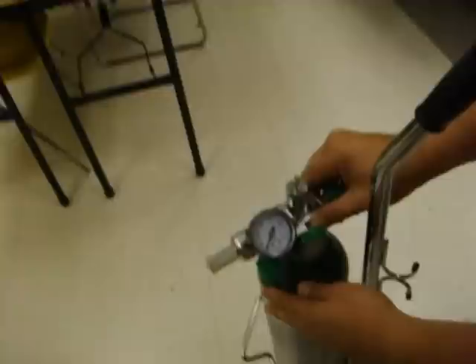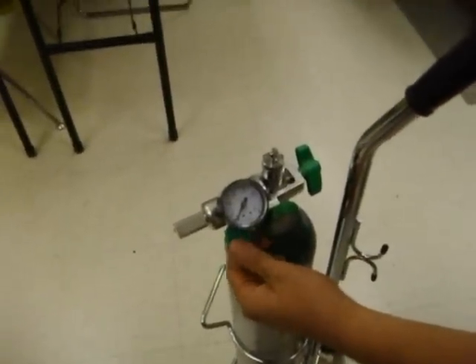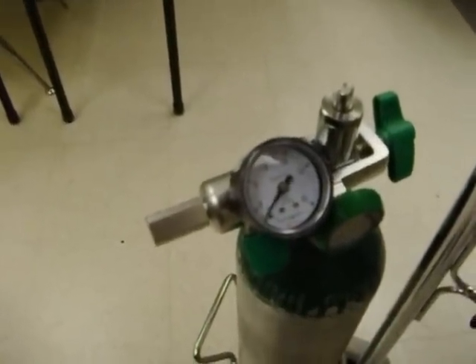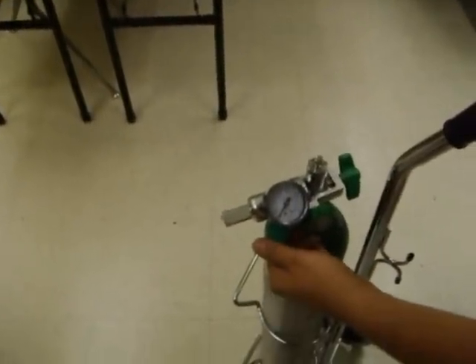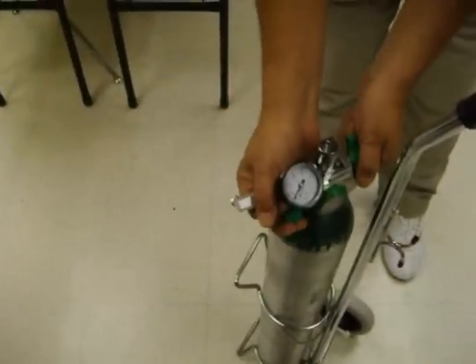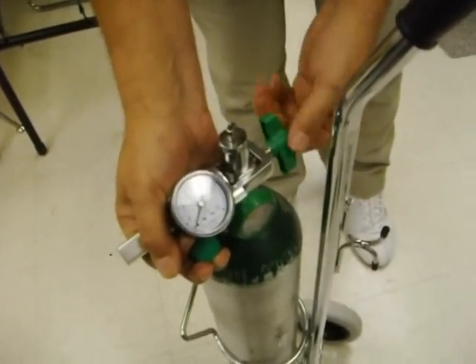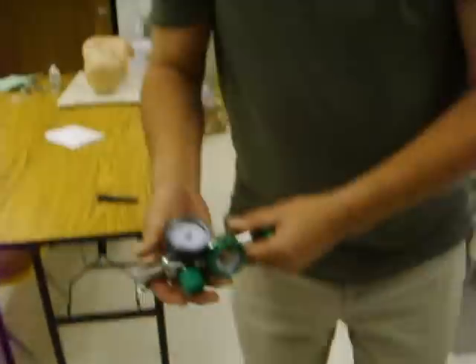Before we take the regulator off, this step is important: we're going to bleed out the pressure through the flow meter. We open that up and wait for the pressure to go back down to zero — the flow goes back down to zero, which tells us we have zero pressure on this gauge. We reshut that for the next person, then grab the regulator and slowly loosen it to ensure there's no pressure, then loosen it and take it off.